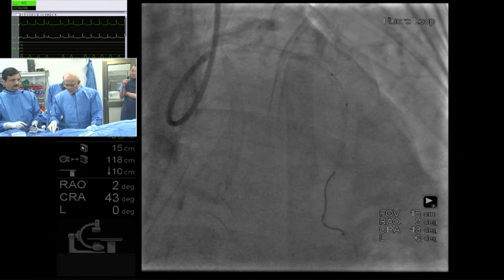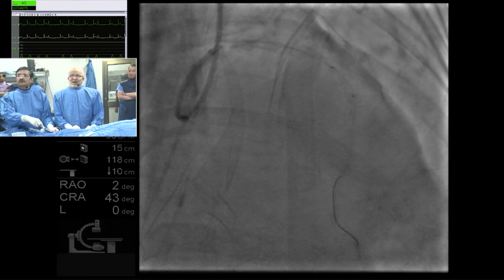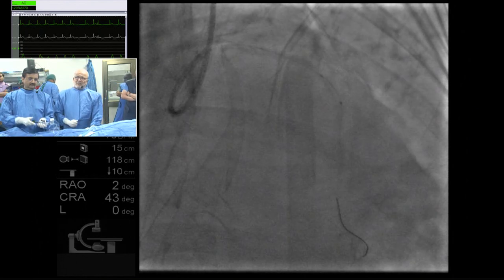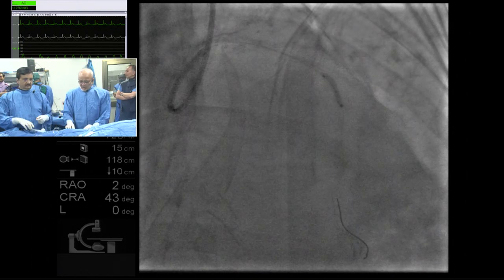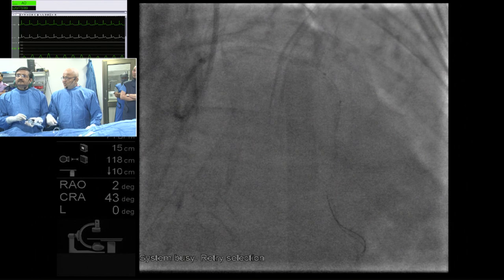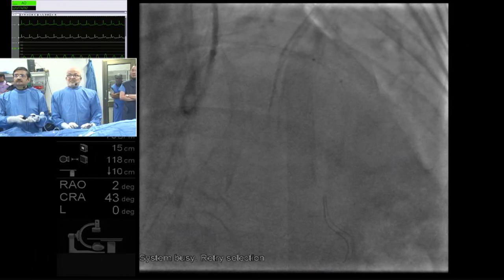Scoring and cutting balloon, yeah, Wolverine also can be used. IVL, by mechanism, will pulverize the calcium over there, and it allows the stent to expand well. That's what they say. But again, there are some limitations like nodule. And the other thing is, in a heavily calcified segment, moving the IVL balloon is also a problem. And that's why I am doing all this preparation.